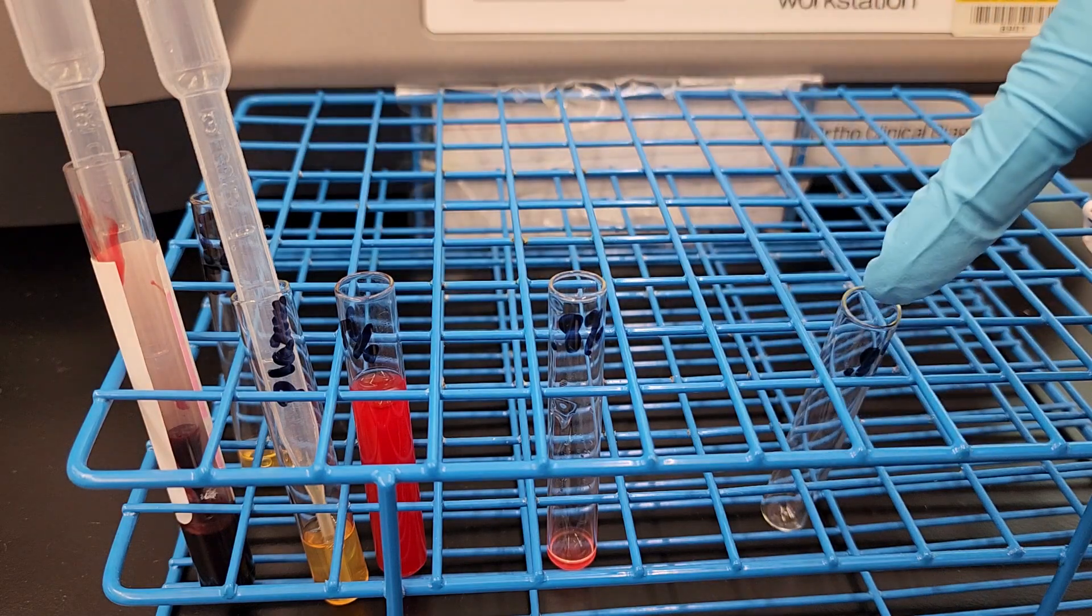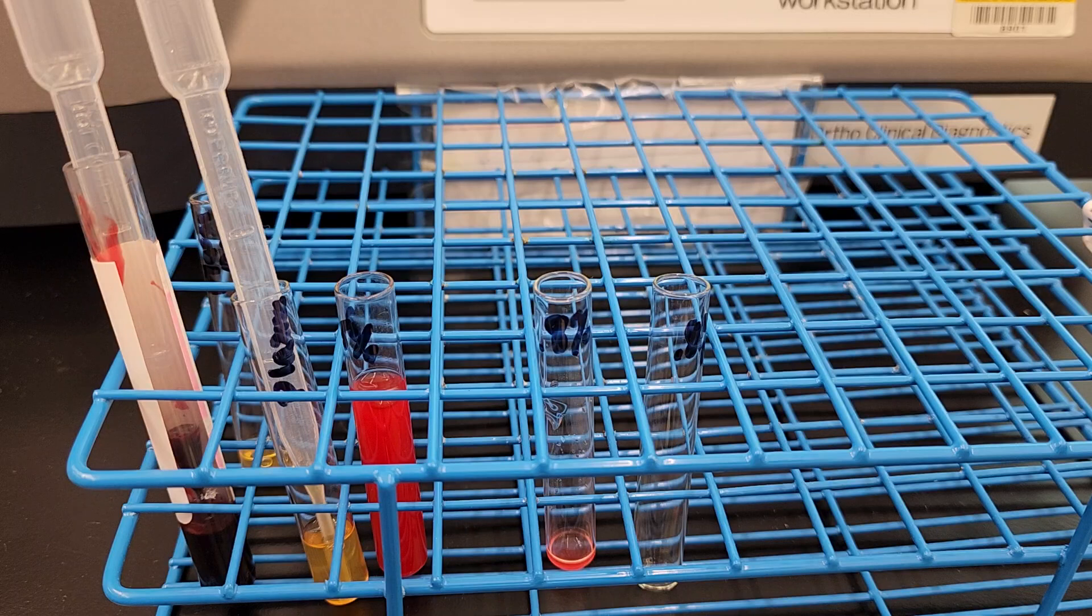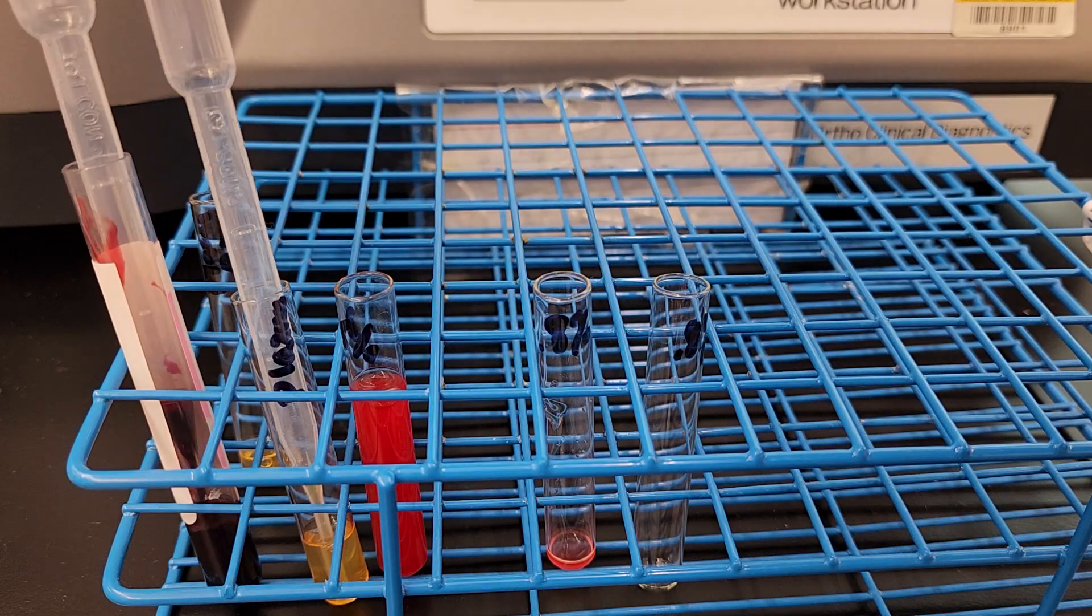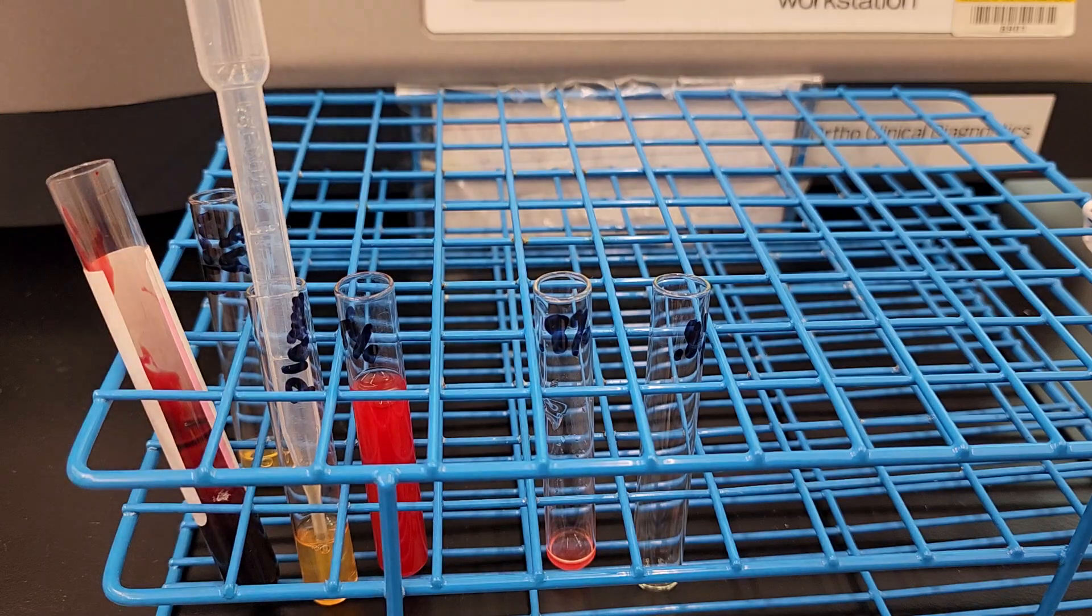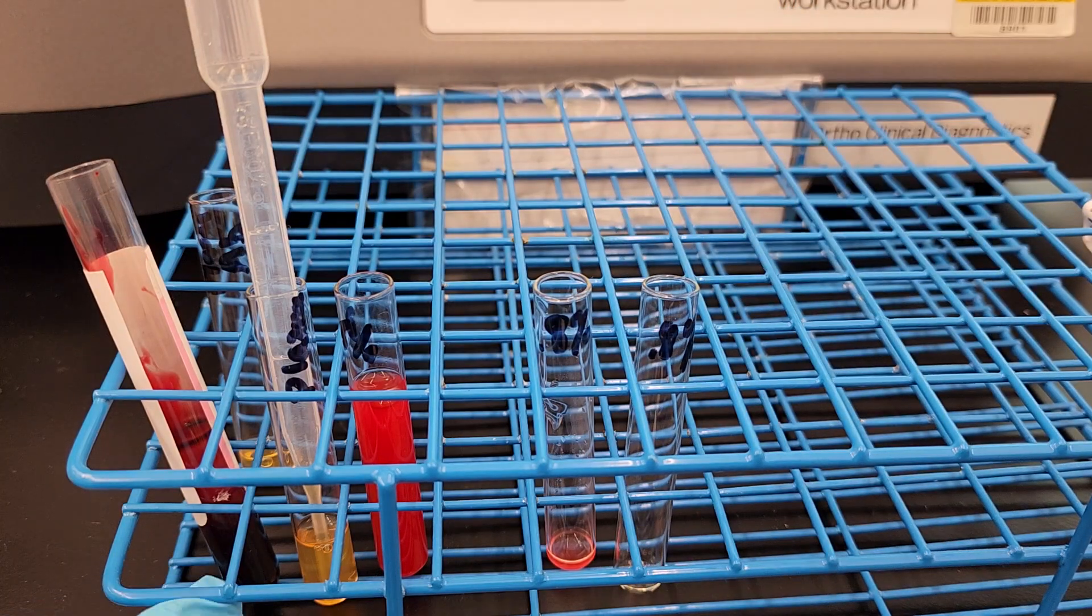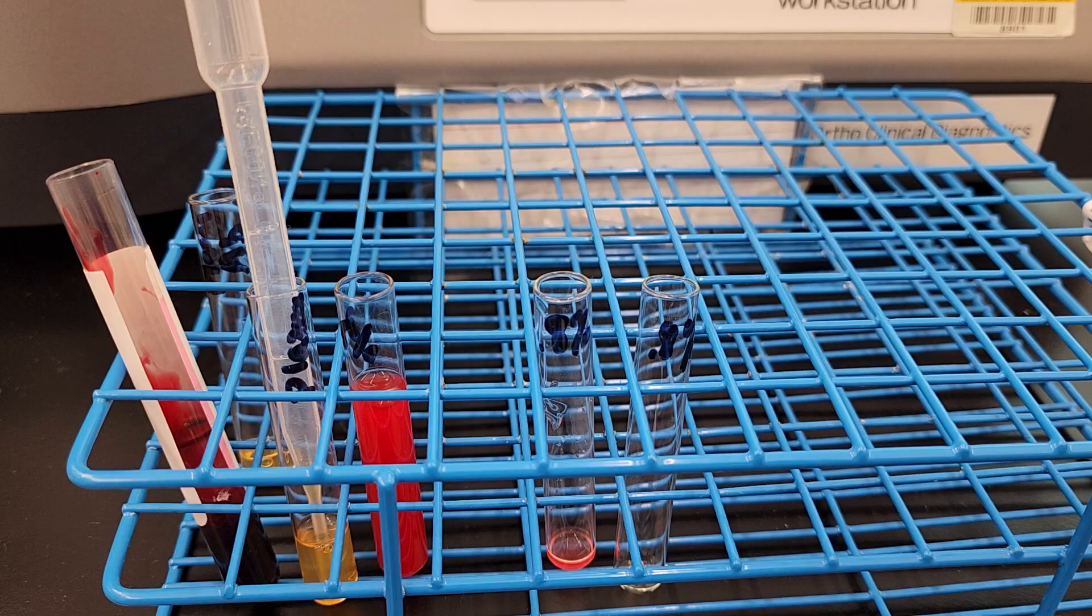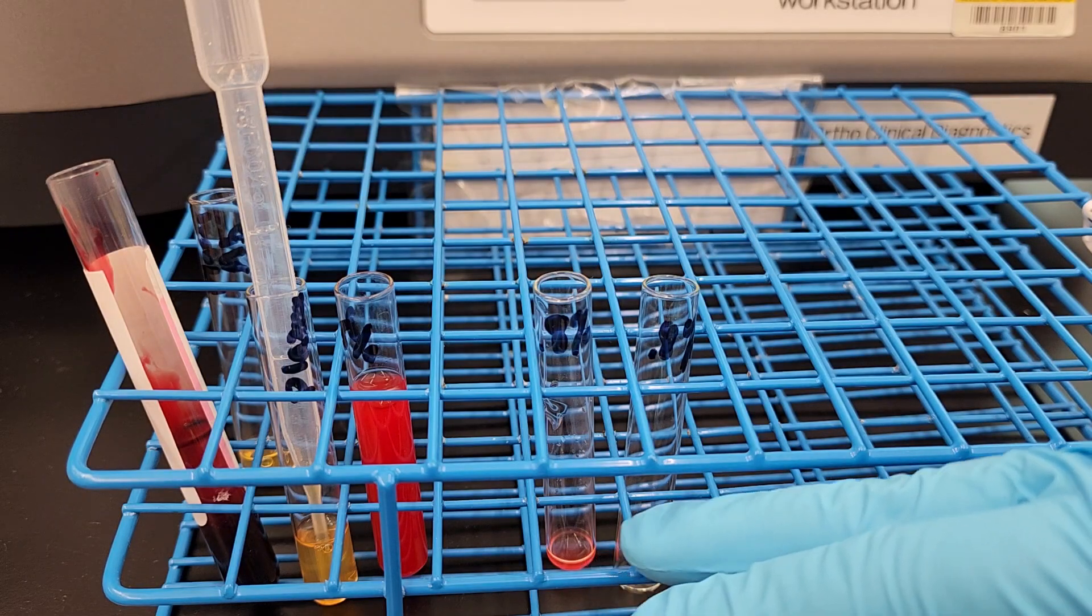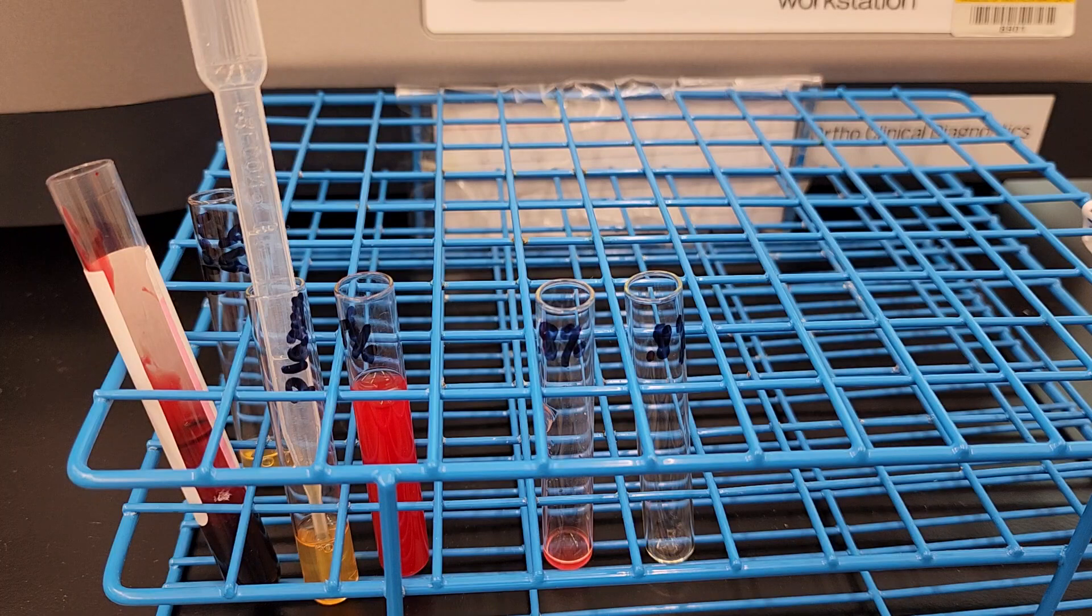All right, so let's go ahead and try the second version of making the 0.8% because you have options in the lab. You have different ways to make things. Obviously, you still have to follow the correct procedure, but you have different ways of making the same thing. All right, so I'm going to pull my packed red cell pipette out, and so for this one, we're going to do 10 microliters of the red cells, the packed red cells from the patient specimen, and we're going to do 1,000 microliters, which is also known as 1 milliliter, of the saline. So let's go ahead and make that one, too. Obviously, we're going to have more volume in this one than we will of this one because of the volumes that we're using. So let's go ahead and get our 10.